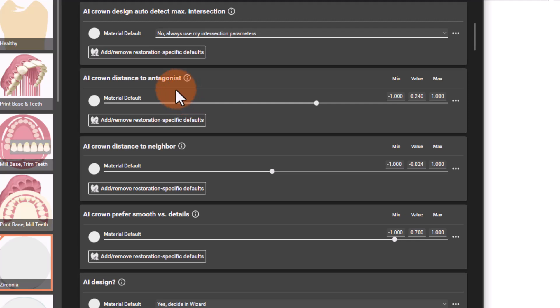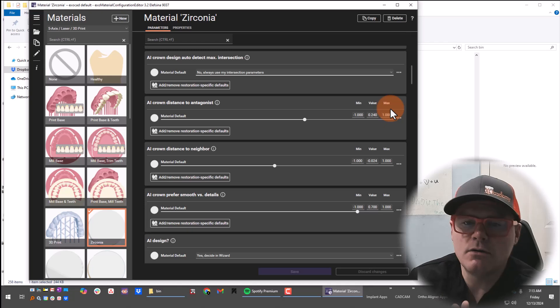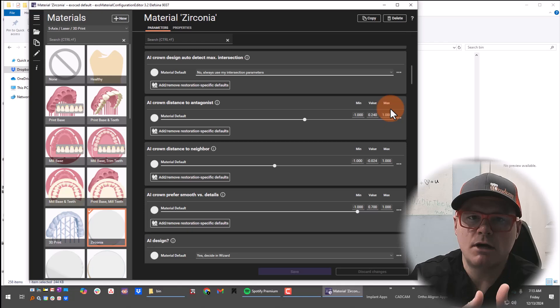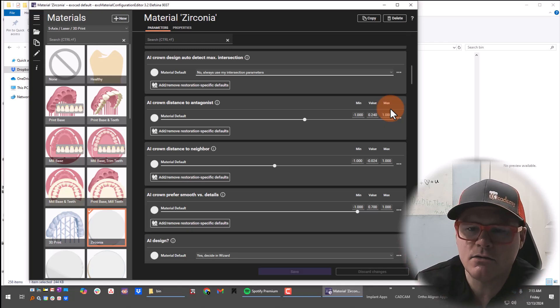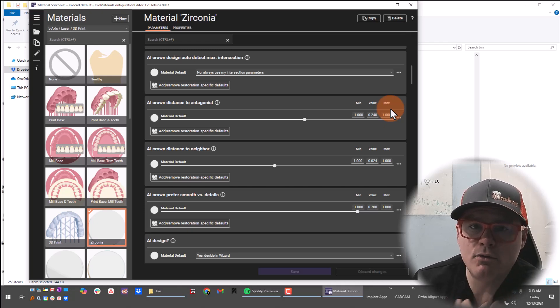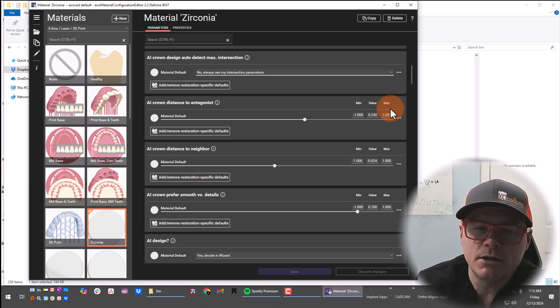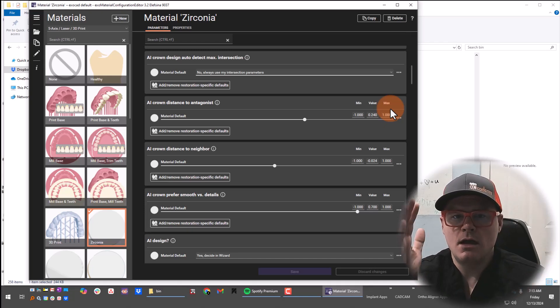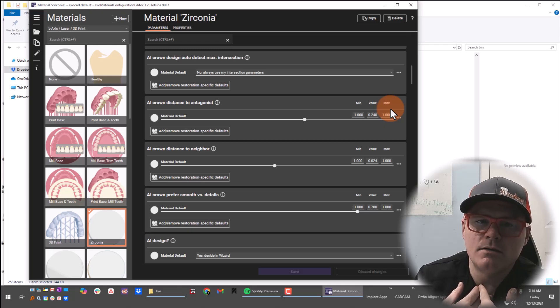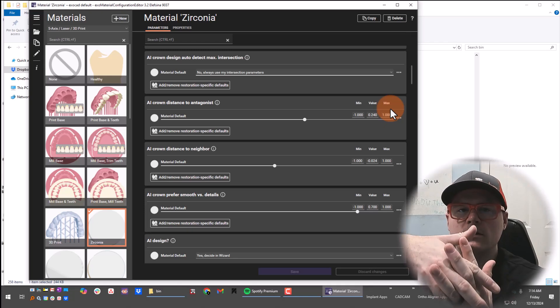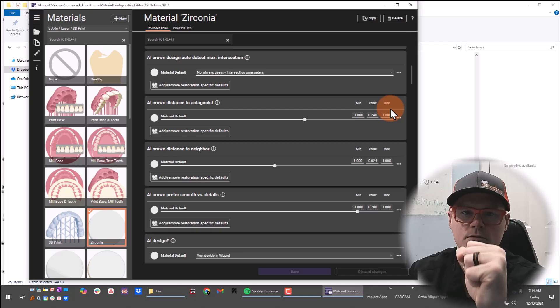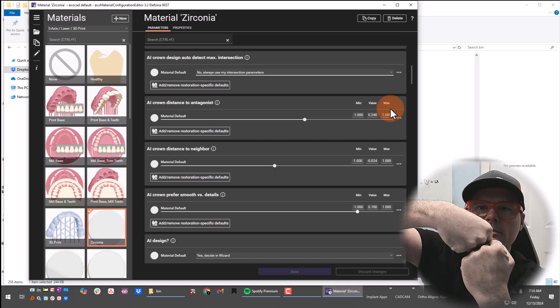AI crown distance to antagonist is basically your distance for occlusion. For me, the minimum value is negative one millimeter to a maximum of one millimeter. A negative value is going to be an intersection of your crown and the antagonist, and a positive value is going to be a distance or space between your crown and the antagonist scan. My value is 0.240 — basically a quarter millimeter of distance. The first reason is that intraoral scans always over-close the patient.